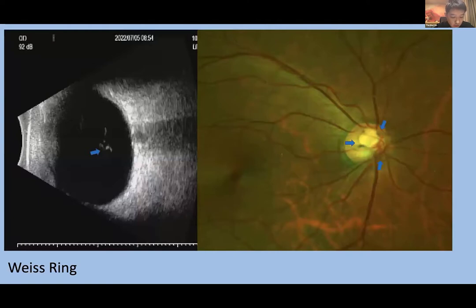We measured the shortest distance of floaters from the retina on ultrasound. Sometimes we took the highest reflectivity in the vitreous at that spot, just like here, and measured the distance to the retina. Some eyes have multiple floaters, like this. We measured both and took the average values. Two investigators finished this work independently.